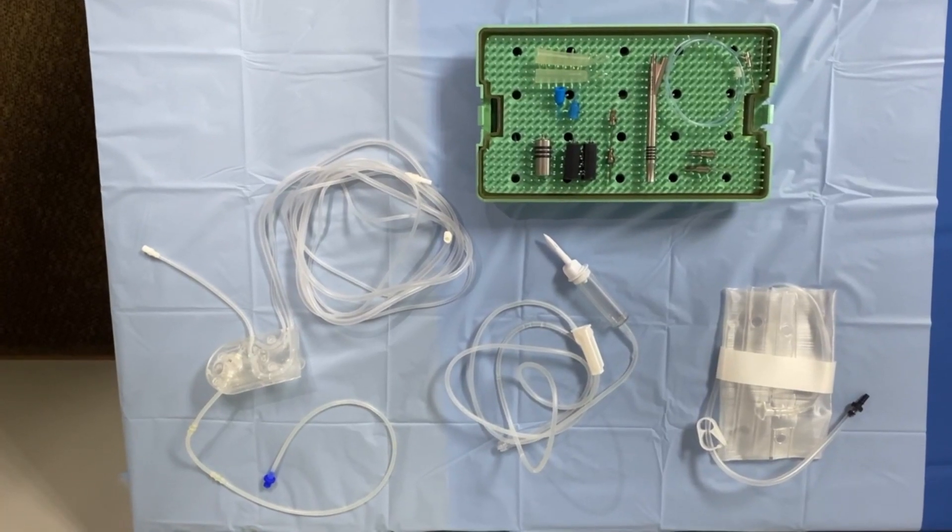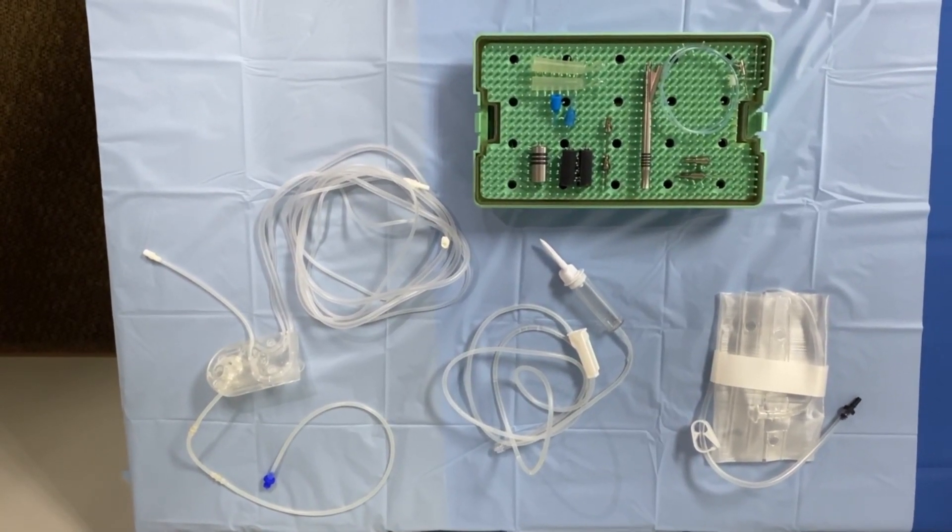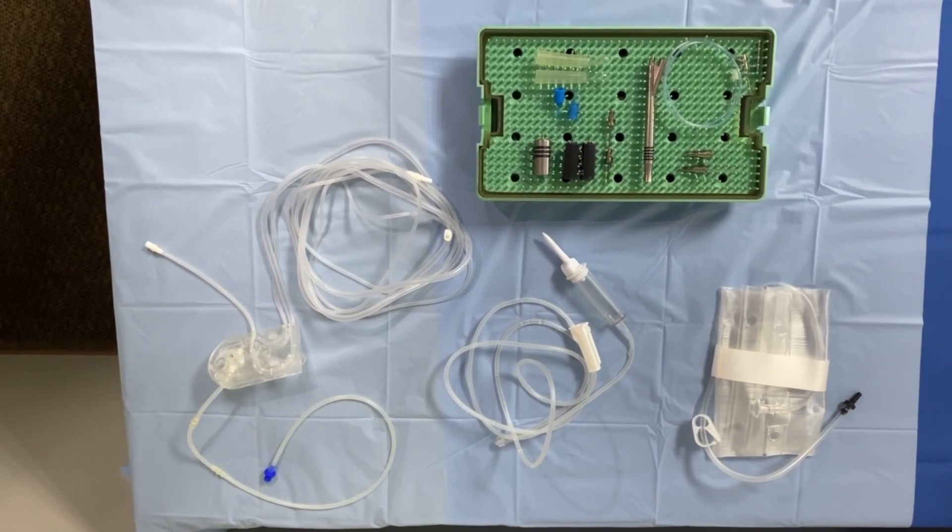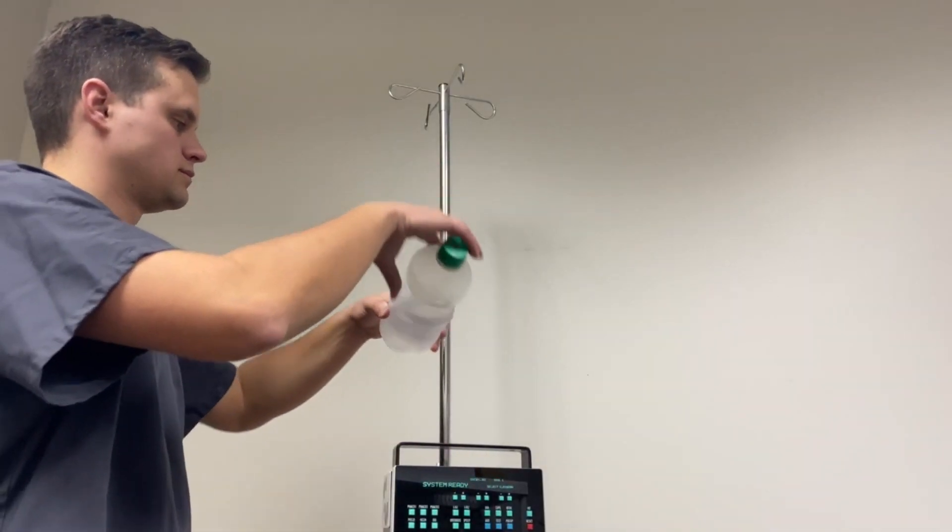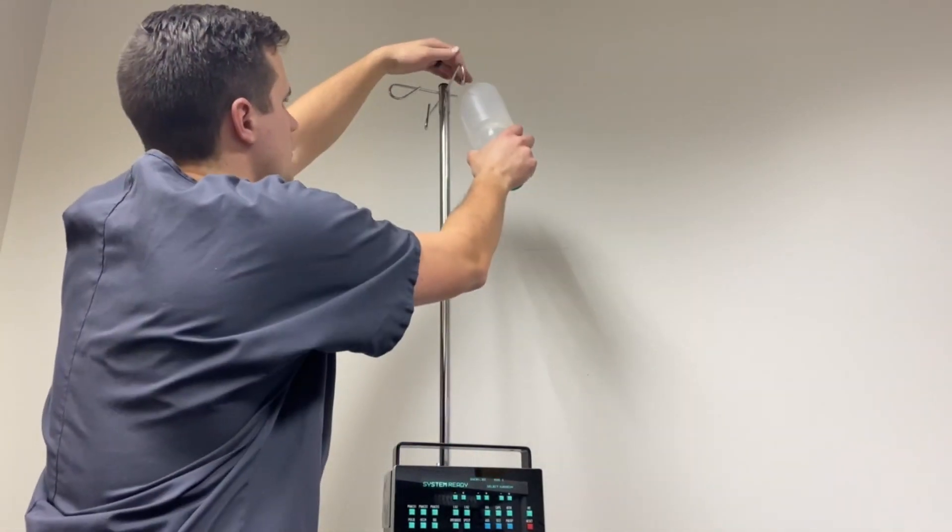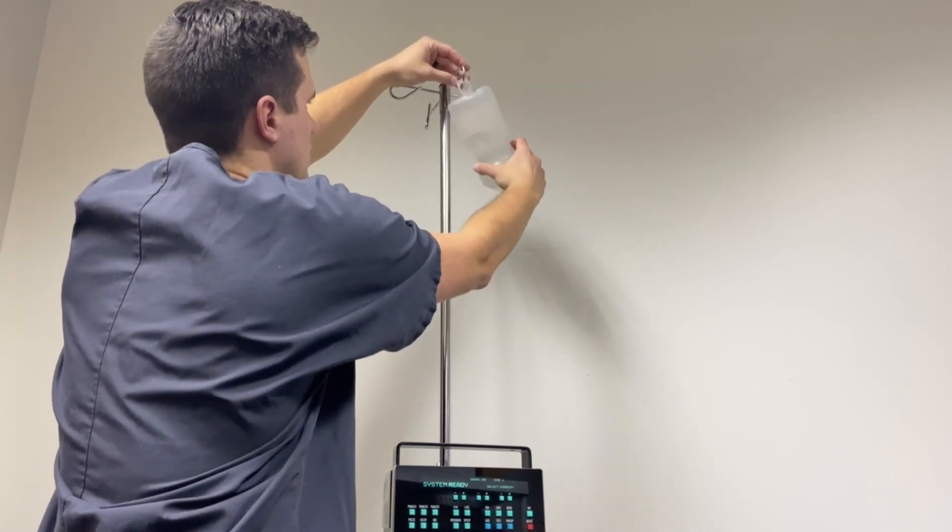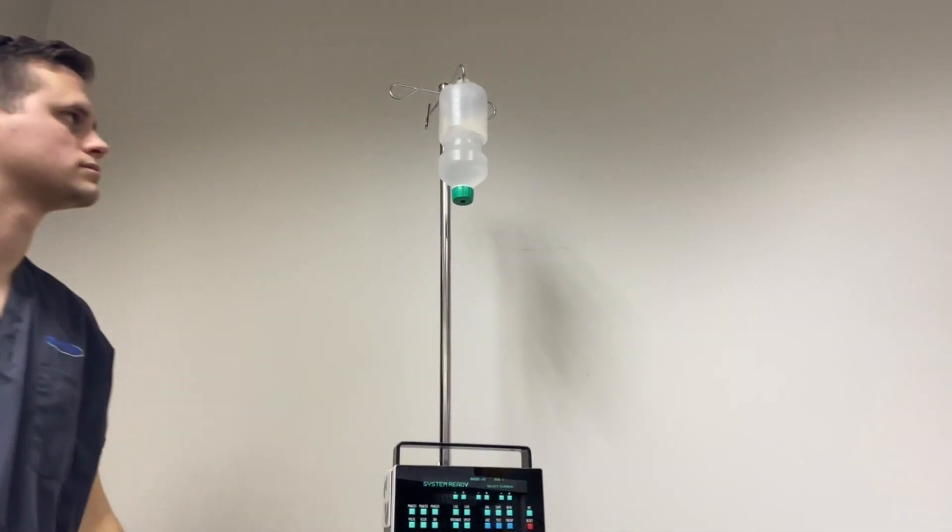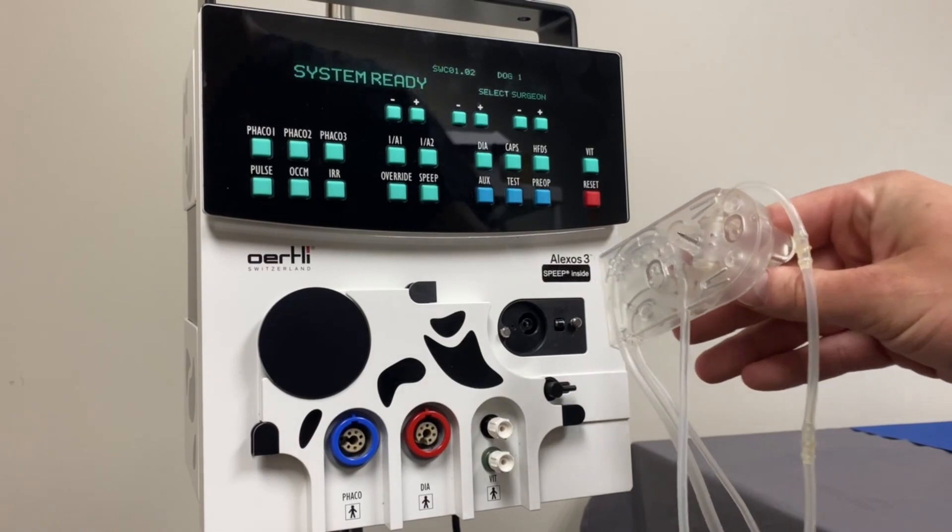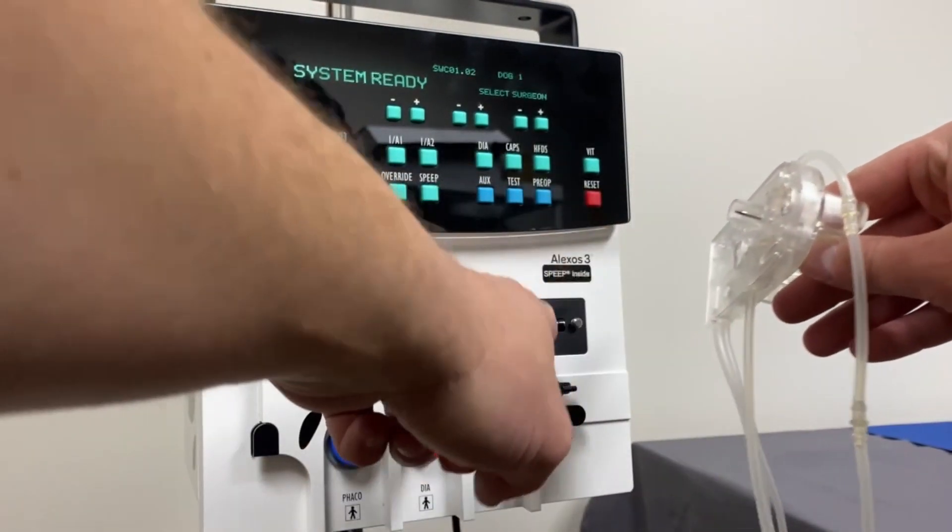Get the handpiece and cassette components ready for setup: FACO tip, sleeve and test chamber, IA cassette with tubing, FACO handpiece. Make sure that the height of the machine is level with the patient's head. Ensure that the BSS bottle or bag is elevated at approximately 100 centimeters above the patient's head. Please pay careful attention to the following step.